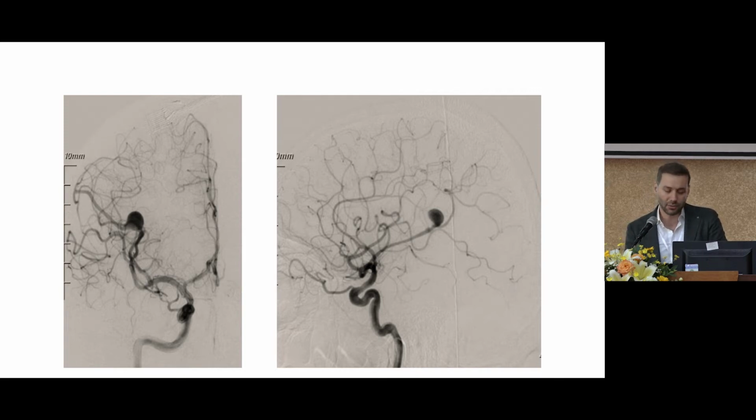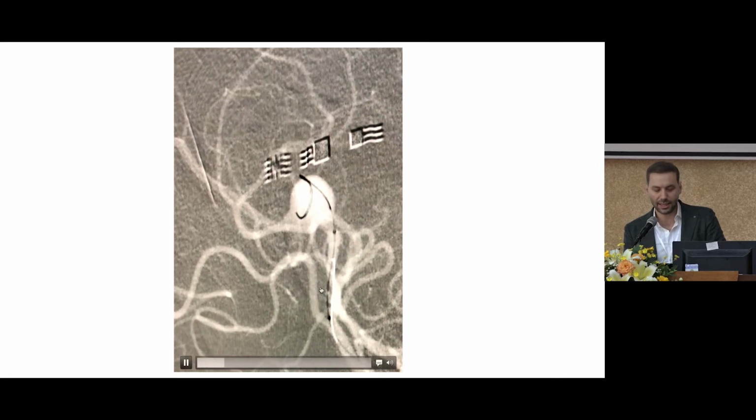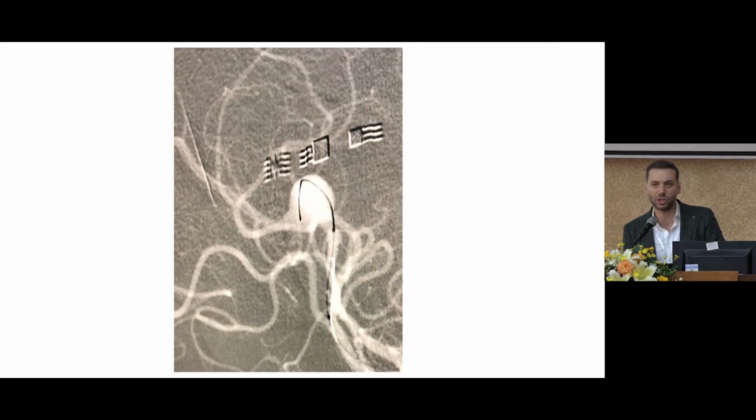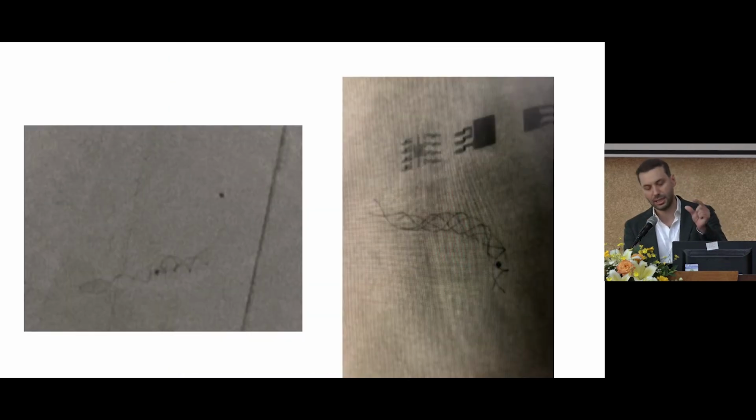So at that time, what we do, by the way, this is the video, direct catheterization was not available in this patient. So somehow we find the exit, then we put one baby Leo, thanks to its also light flow diversion feature, and then we get through the first stent, then deploy with a telescopic fashion the second one. So two braided stents, two baby Leos implanted telescopically.